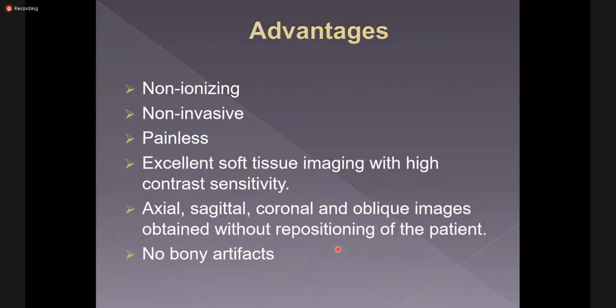What are the advantages? The main advantage is that it is non-ionizing radiation. It can be used in pregnant females or during lactation. It is non-invasive and painless. The patient just has to lie down. It gives excellent soft tissue imaging with high contrast, very good contrast compared to CT or other imaging modalities.